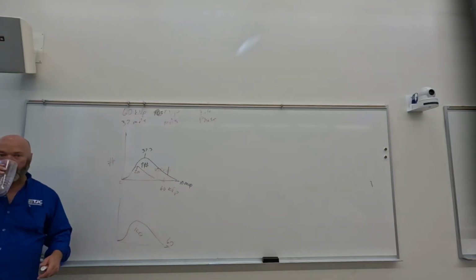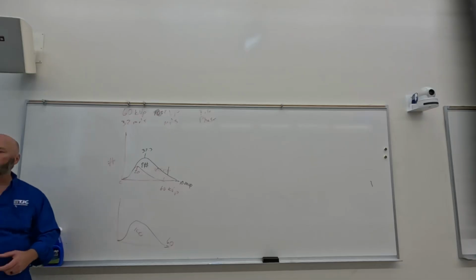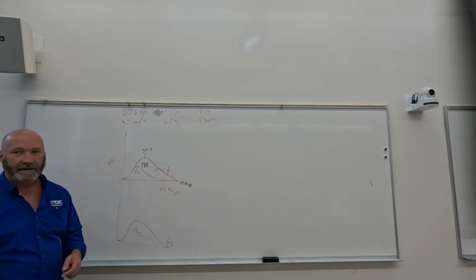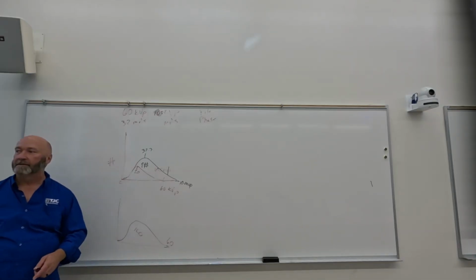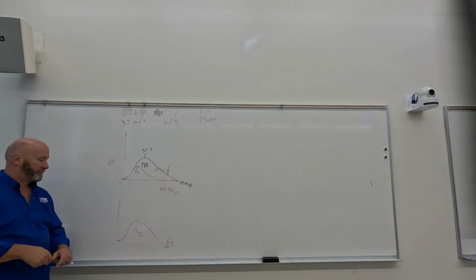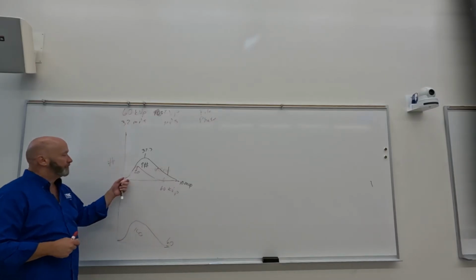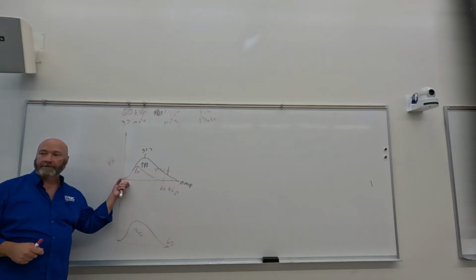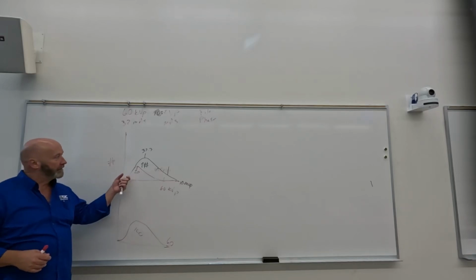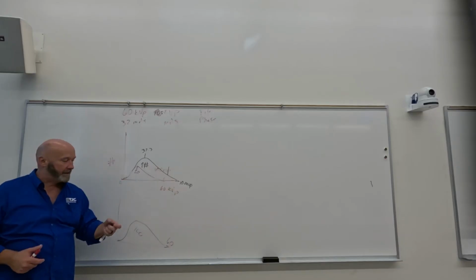The peak energy, no. You just add numbers, right? So what is mAs? It's milliamperage seconds. What's an amp? It's a count of electrons. You're sending more electrons across the tube, which translates into more X-ray photons, but it doesn't do anything to the minimum energy. Oh, let me back up just a second. kVp has no effect on the minimum energy, okay? So kVp increases the numbers, it increases the average, and it increases the peak energy.